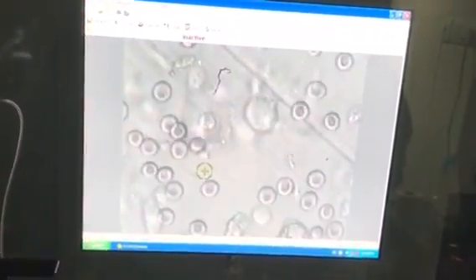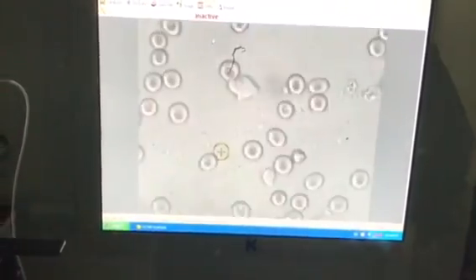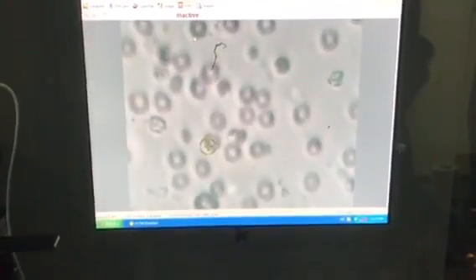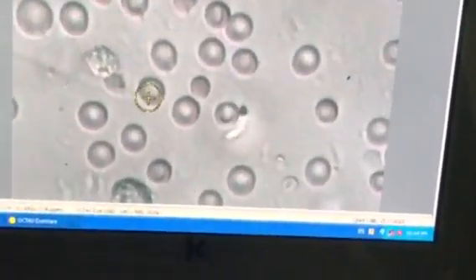Now I will look for some more — I am expecting more sperms. See, there is another motile sperm. The sperm is floating in the upper layer.